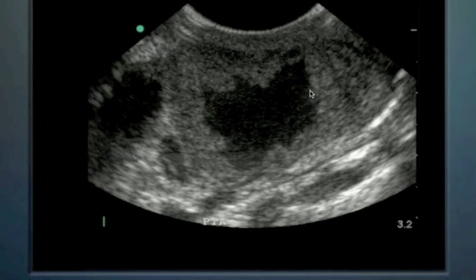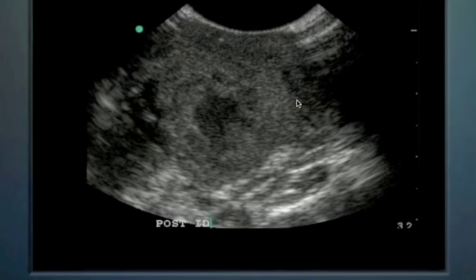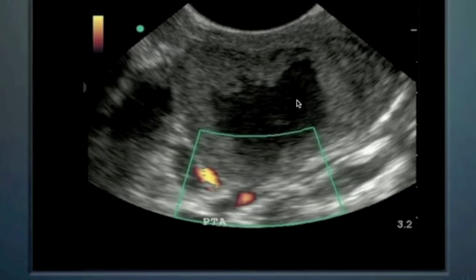And this is the intracavitary transducer we have in the mouth, and we can see this very prominent peritonsillar abscess here. One of the other interesting findings is when we apply color Doppler back here, we can actually make out that there are some blood vessels back here that we want to stay away from when performing the procedure. So in this case, this is the posterior pharynx here. The distance the needle would have to travel is just over a centimeter in order to get into the space that is the peritonsillar abscess. So we have an idea of how far we need to go when we'll start to see some pus come back.